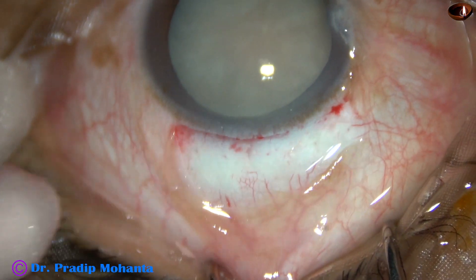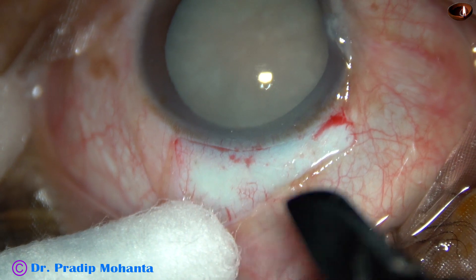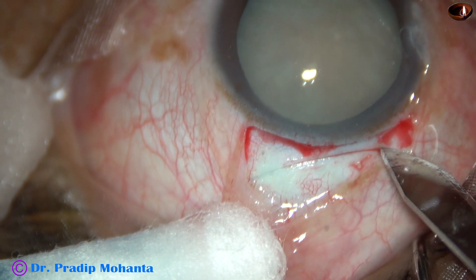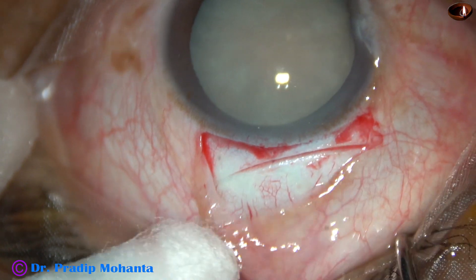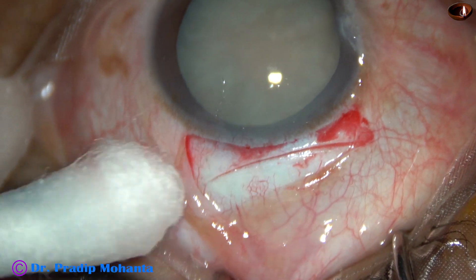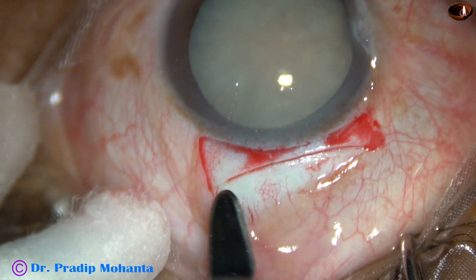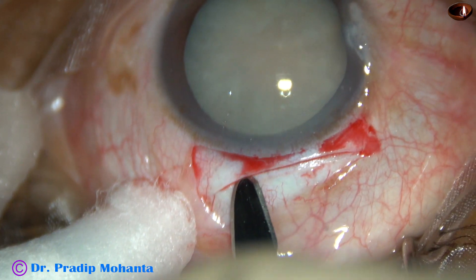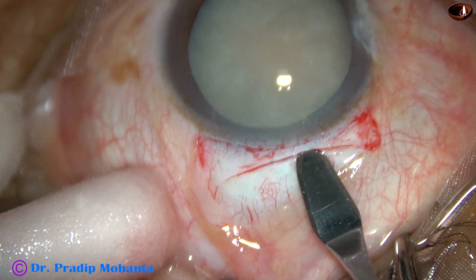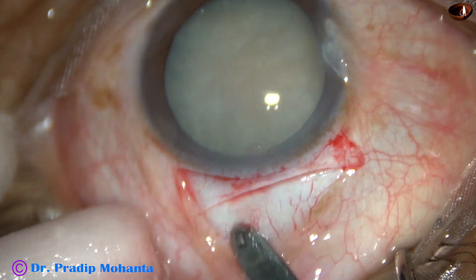The cautery is done and now a very important step: the incision. I do this with a 15-number crescent blade — this is a mild frown incision, about 1.5 mm away from the limbus at the central part. See that the groove is of equal depth all around. The bevel of this crescent blade is about 250 microns and this depth is okay.